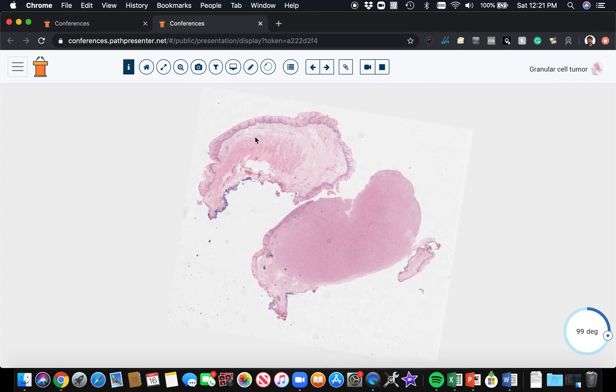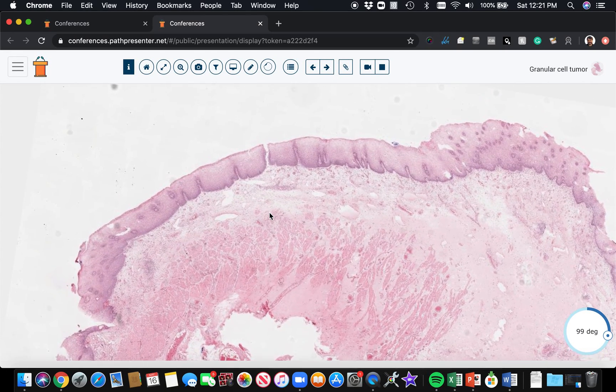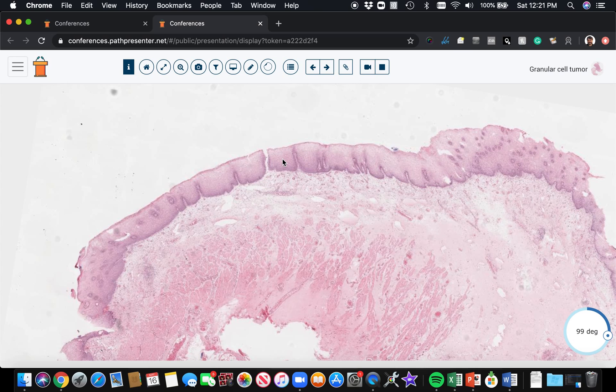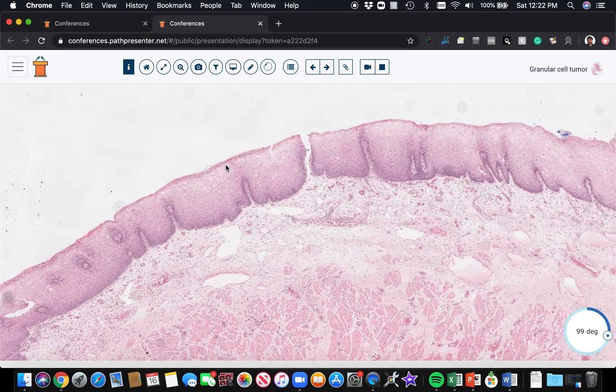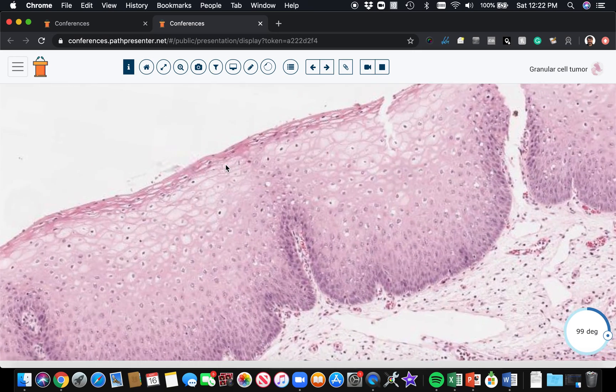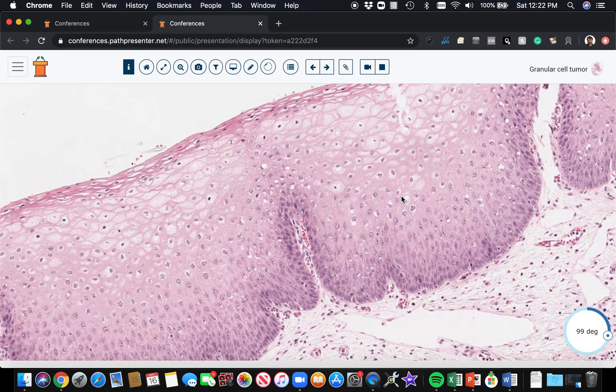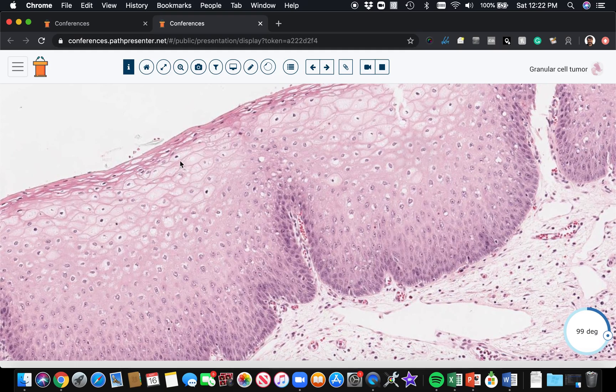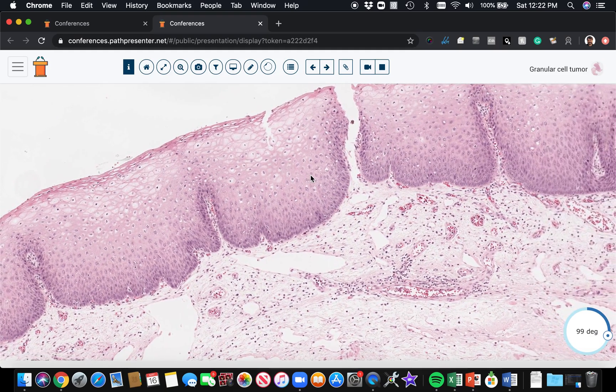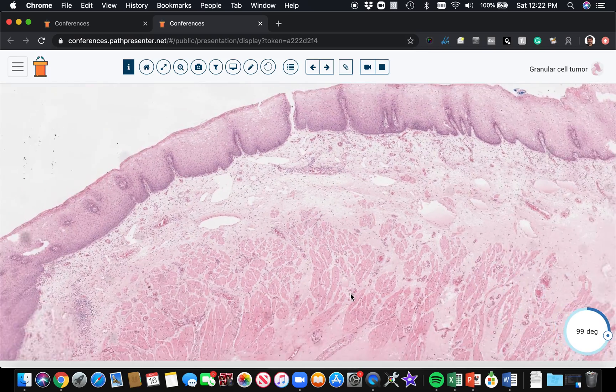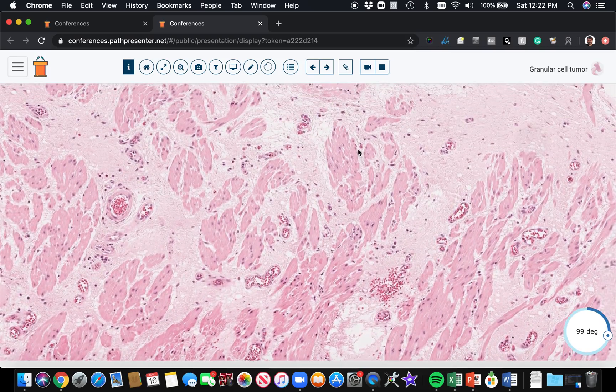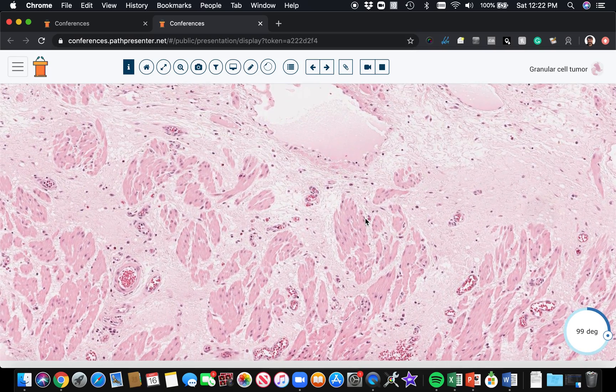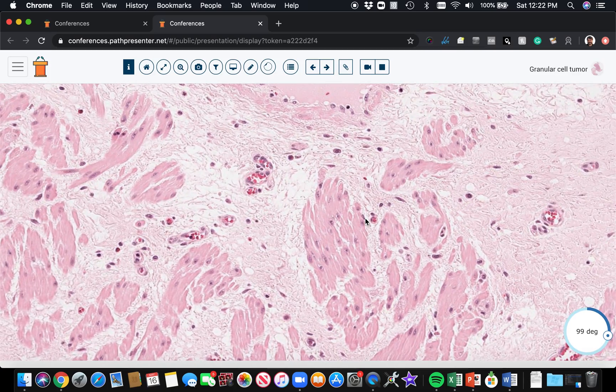I don't know the history on this one for sure, but I think we're dealing with a nodule in the vulva or vagina because we have either the labia minora or the vagina, I suspect. What we have here is squamous mucosa with those vacuolated glycogenated cells up top, and it lacks a granular layer and stratum corneum. Down underneath, we've got numerous small bundles of smooth muscle, so that's why I would suspect this is probably from the vulva or vagina.